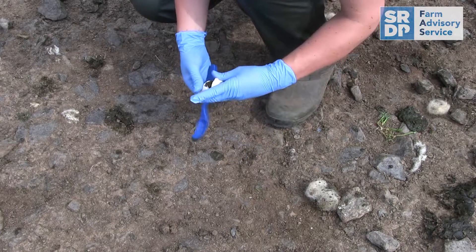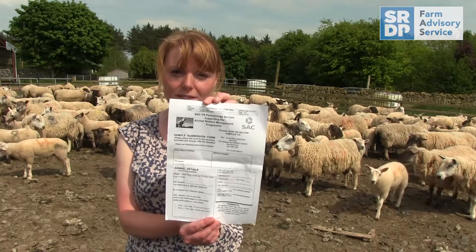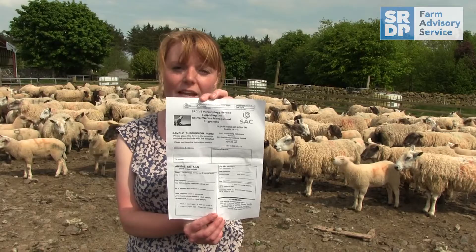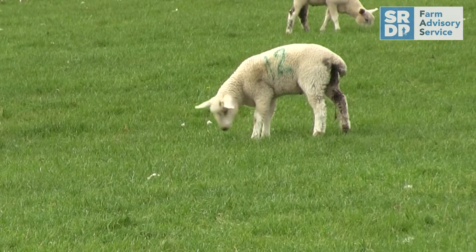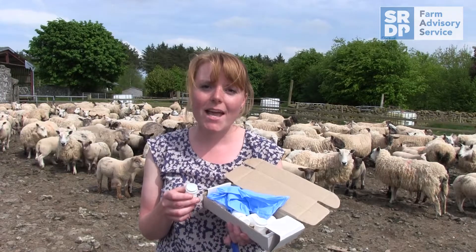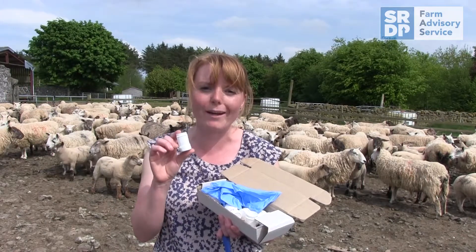Once you've collected the sample, you'll have to fill out a submission form, and this helps the person doing the analysis interpret the results. Try to make sure that this form is filled out with as much relevant information as possible, such as the age of the lambs, whether they've been treated, and what products they've been treated with. Following this approach is important — if you're going to pay money for a worm faecal egg count, making sure it's done to the standards for accuracy is important to make sure it's worthwhile to you.